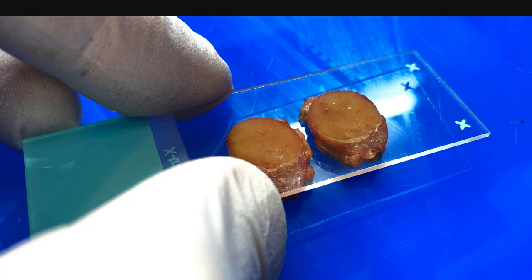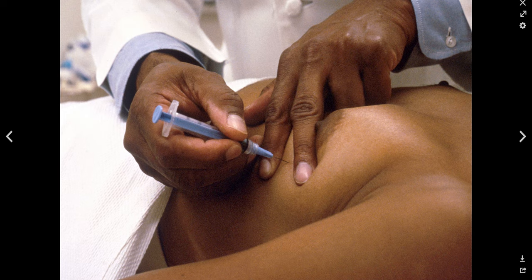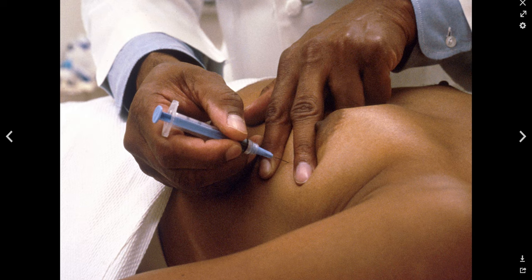FNA as you can see here, the sample collected is more liquid and you put it on the slide, you put the aspirate and then you dry it and then you do a DIFQUIC stain and any remaining aspirate you do a PAPS stain because that again helps you better visualize the nuclear features and then the remaining aspirate you can put in a cell block.